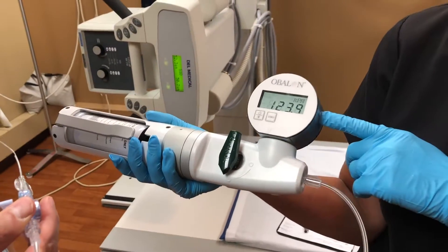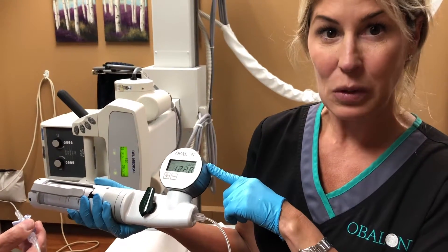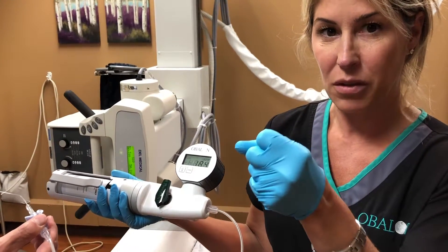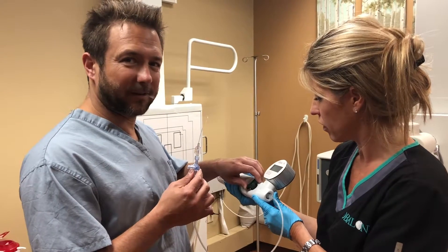So what we're looking at right now is that this is the device's way of verifying that the capsule is in the stomach, and we're just waiting for the veggie cap to release from the balloon around it. Now we're gonna inflate the balloon.